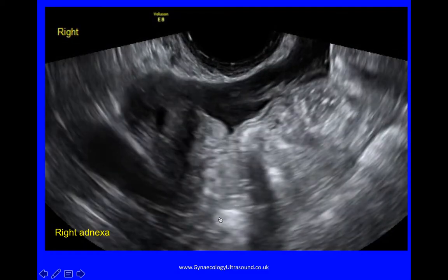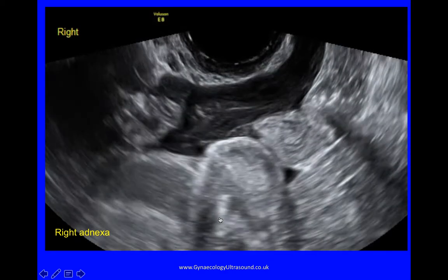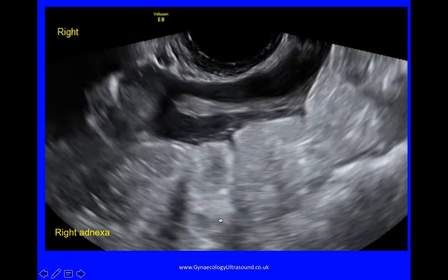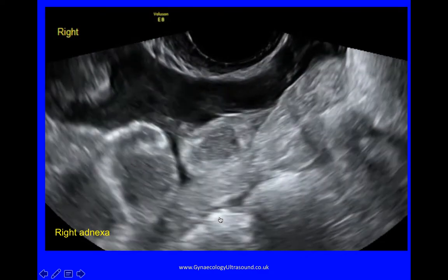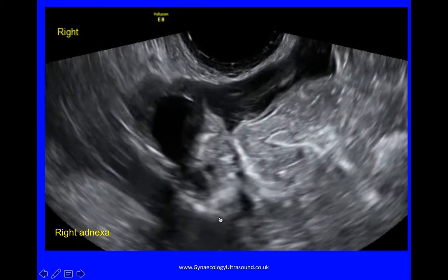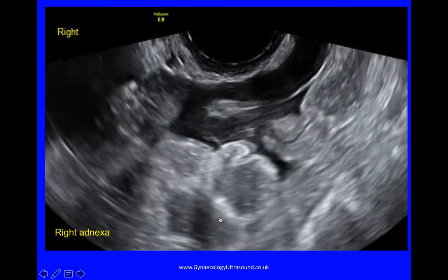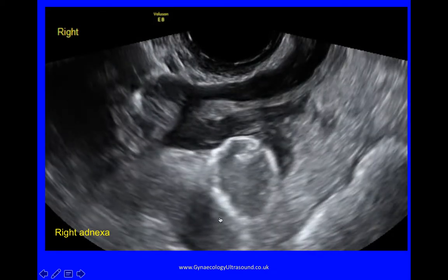This is a transvaginal view of the right adnexa scanning from right to left toward the uterus. Just looking at a structure. Just look at that again, scanning from right to left, from lateral to medial, through the right adnexa. Transvaginal ultrasound.